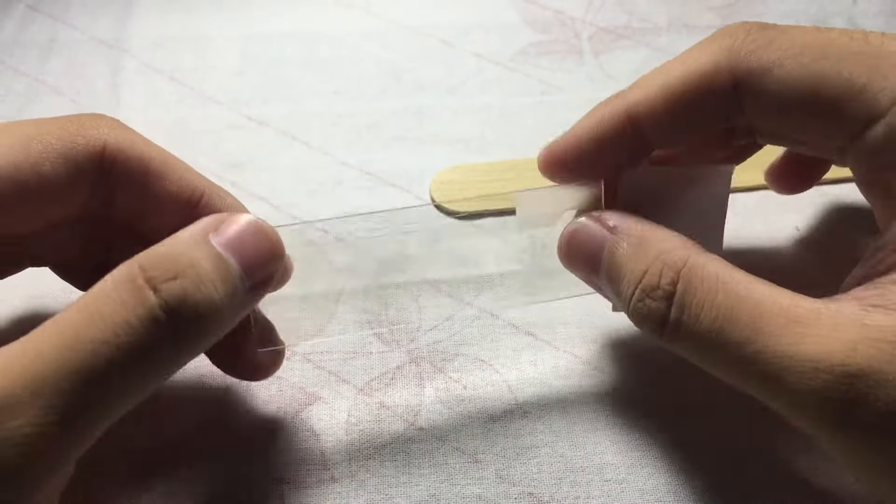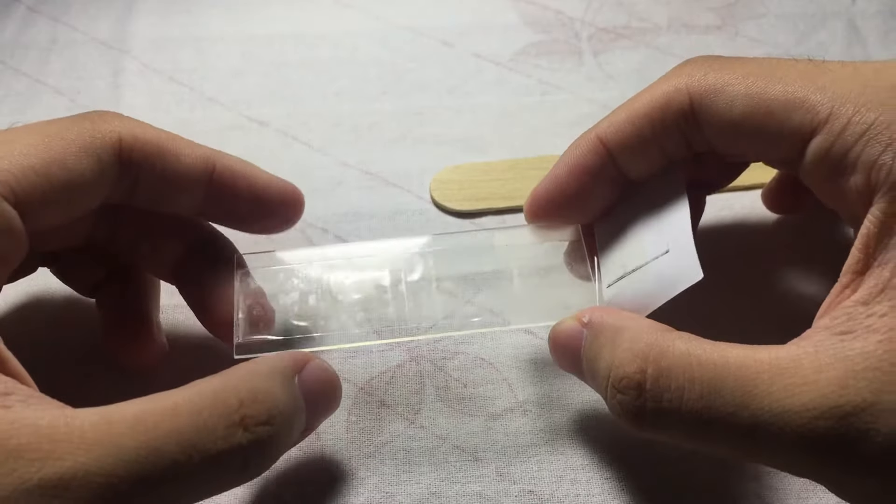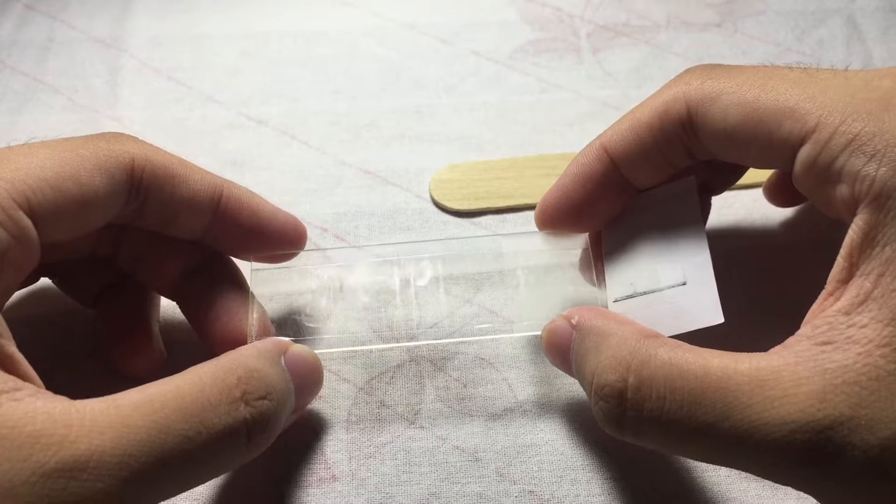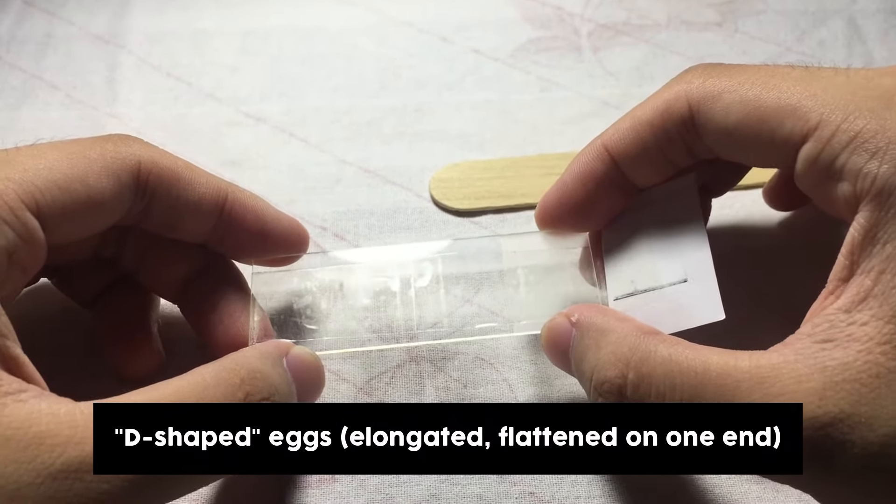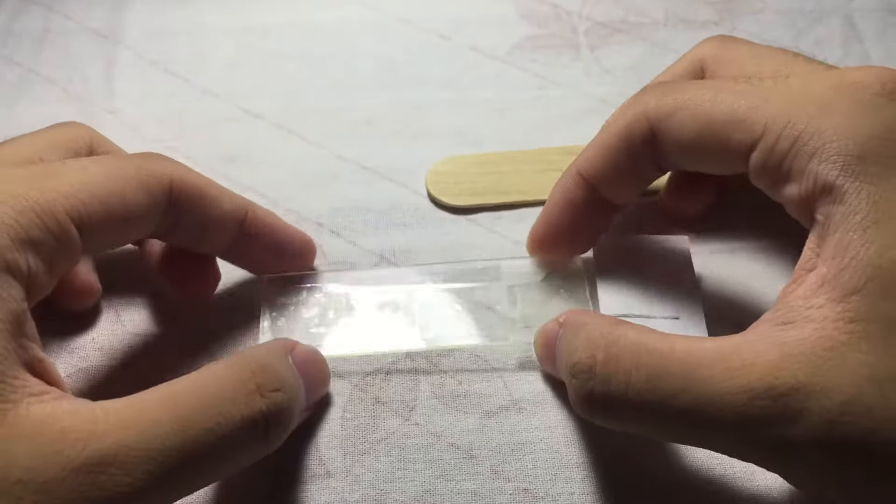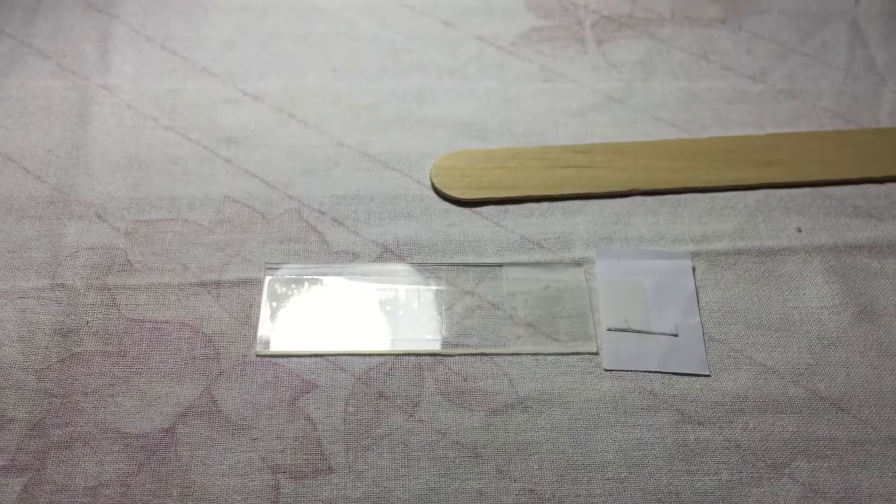We can examine it under the microscope using LPO and we can use toluene or xylol to clear the preparation. Examine and look for the characteristic eggs of Enterobius vermicularis: D-shaped, flattened on one end, and elongated. That's all for your scotch tape swab.